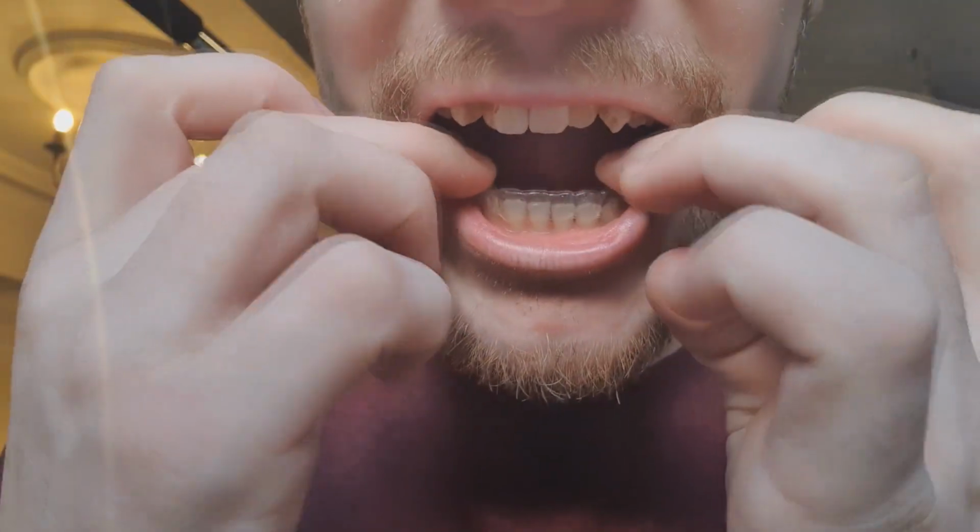So like I say, if it's towards the end of the week, I'm usually needing to brush them quite a bit. Now, I don't use anything to brush them. I don't even bother with toothpaste. It doesn't really seem necessary for me. Soaking them seems to do a nice job, and then just brushing them with water for like 30 seconds is enough for me for them to appear clean. I don't see any need for going any further than that or spending any more time on this, because it already takes up a lot of your time. So that's all I do, and it works for me. We rinse them off, give them a scrub if we need to, and then pop them back in.